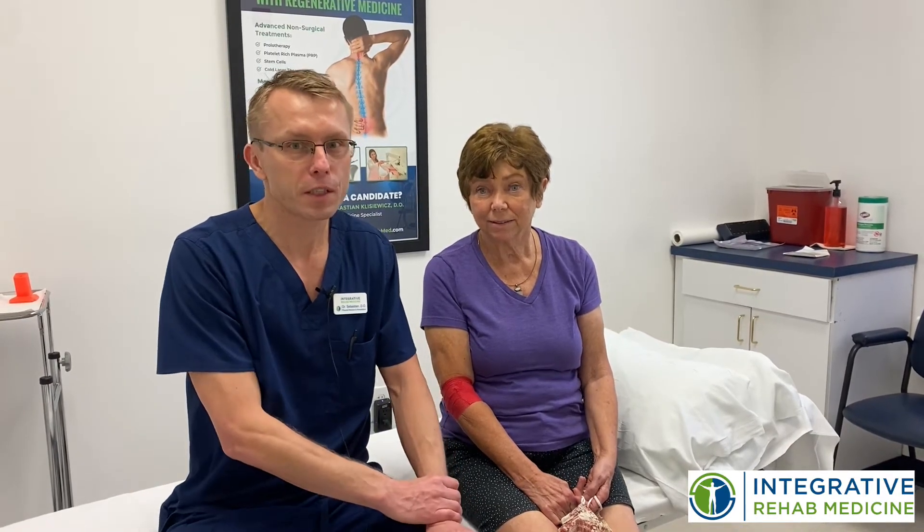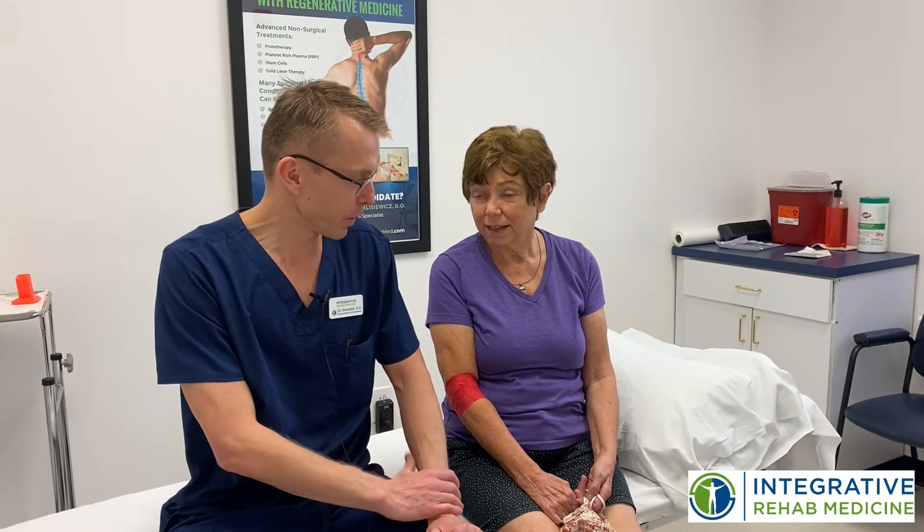Hi, today I'm here with Lee. We're going to be doing a nerve hydrodissection with platelet-rich plasma. Lee has had her nerves of her legs and arms destroyed by Guillain-Barre syndrome and we already did one treatment for her legs. Can you tell us a little bit about it?